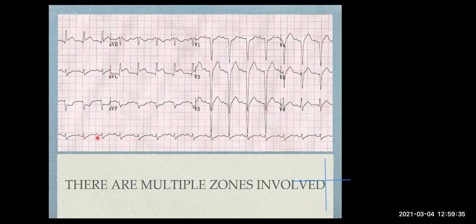And then we have a look at our PR interval. We've got 1, 2, 3, 3.5 to 4. So it's still within normal. Our QRS complexes, however, are starting to look a bit wide. They're not 100% thin, but there's another reason for that. We're not going to get into it too much now, but for the sake of argument, we'll call them borderline for now. And we've got a QRS after every P, and it's quite regular. So for right now, we're just going to say we have a sinus rhythm.